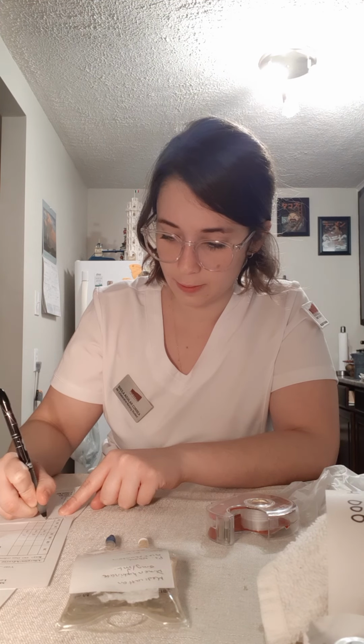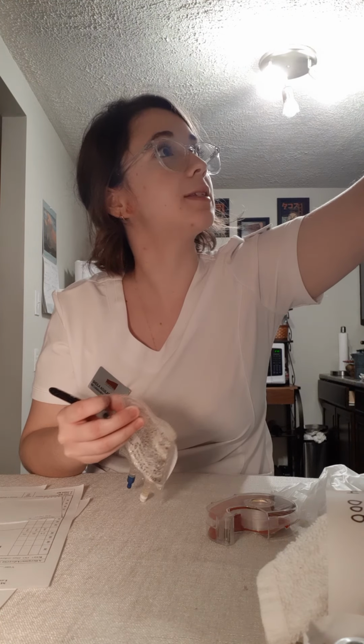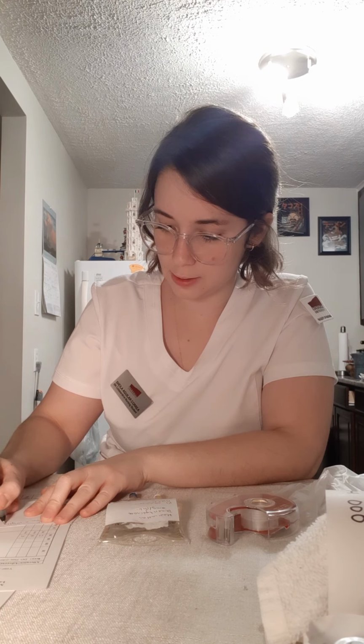It will be useful to calculate the rate since I'm here. I added 1 milliliter to the 50 milliliter bag, so I got 51 milliliters that I'm going to give over 20 minutes, and the drip rate is 10 GTTs per milliliter.